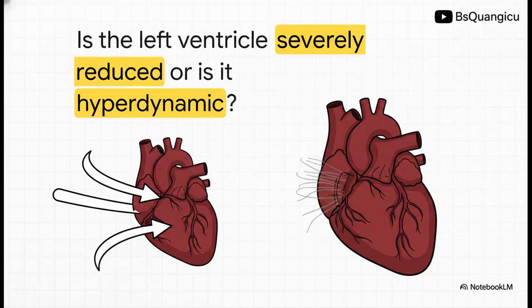Let's focus on that left ventricular squeeze for just a second. Watch the ventricle through the cardiac cycle. If you're seeing a hyperdynamic squeeze, like the heart is pumping as if it just chugged 3 espressos but the tank is completely empty, that's a huge clue pointing toward distributive or hypovolemic shock.